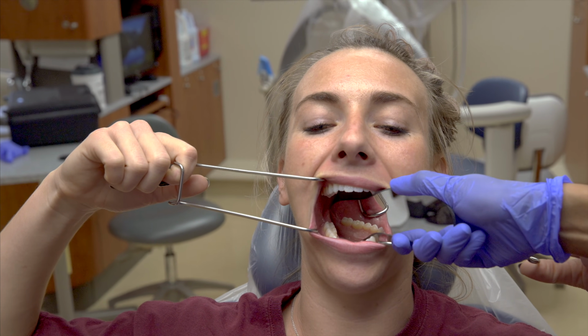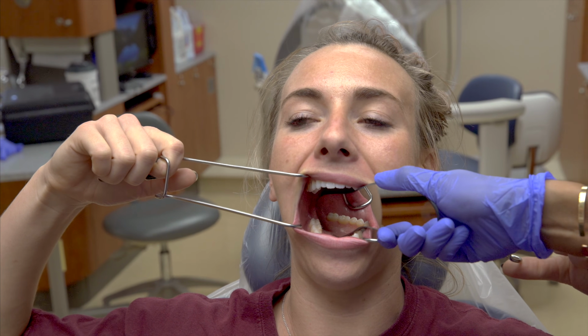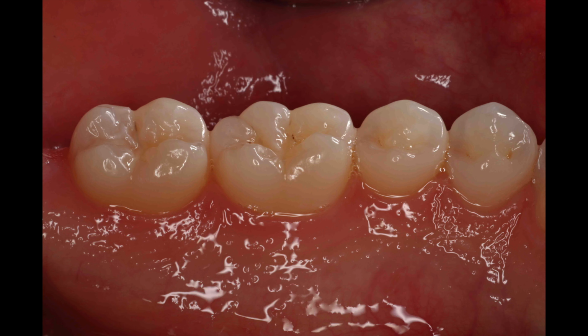Once you have that angle, push the mirror towards the tongue, keeping it at the same angle. Again, you'd like to zoom in enough to see the distal of the canine and the distal of the last molar. Also, remember to have the patient move the retractors so that no lips are in the way of the photo.